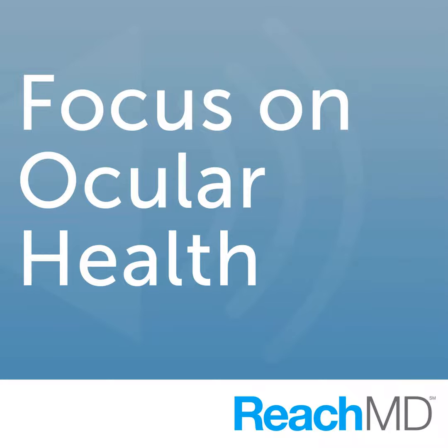And if we're wildly successful and we get the resolution and imagery we get, then we hope to go beyond putting them in people who are completely blind to those who are visually impaired. But right now, the device is being put in under an FDA trial only in patients who have retinitis pigmentosa, this inherited condition, and who are completely blind. This prosthesis really works in a situation in which the optic nerve and some of the visual cells, or at least the nerves in the retina, are still functioning.